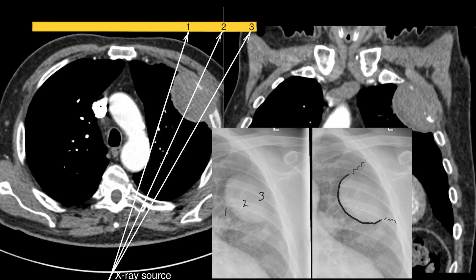One represents the medial part of the lesion, which is very sharp. Two represents the centre of the lesion. And three represents the periphery of the lesion, where you've got increased density but no sharp margin.